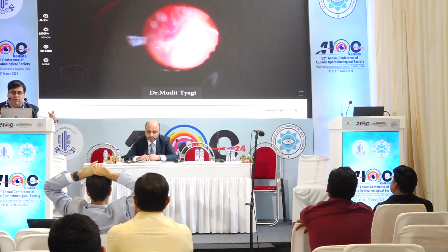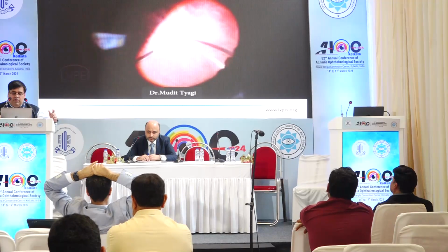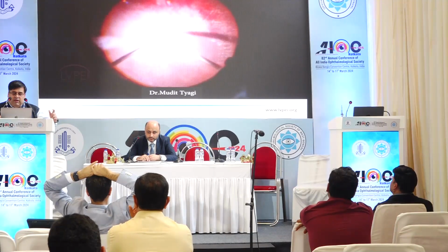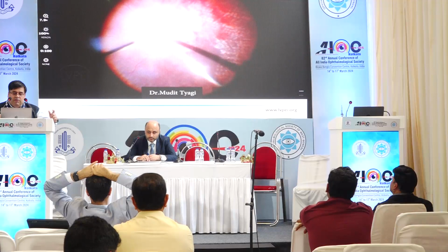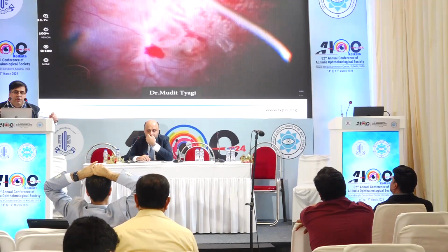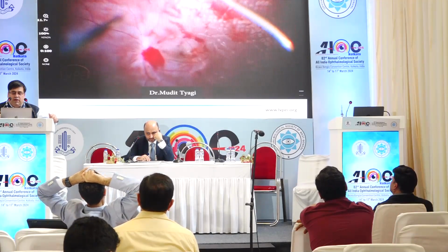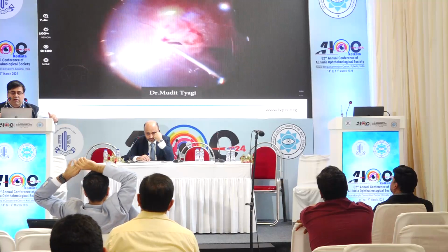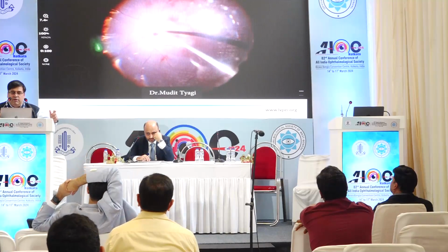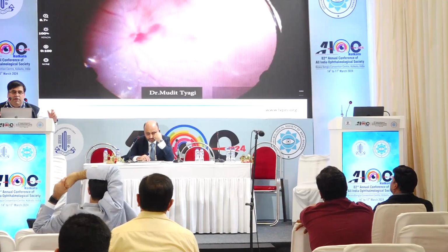So in this case of diabetic, we have removed the membranes, the disc proliferation came out easily, and then we realized there is a bleeder happening from the disc. Bottle height was raised, you try and press on the disc with your blunt cutter, but it kept on oozing and oozing again. Tried multiple fluid exchanges, again it is filling up. Such eyes, if I leave it on gas, by tomorrow I may have a dispersed heme.